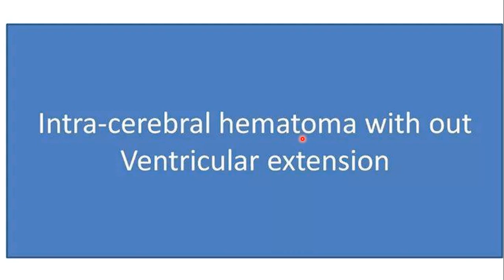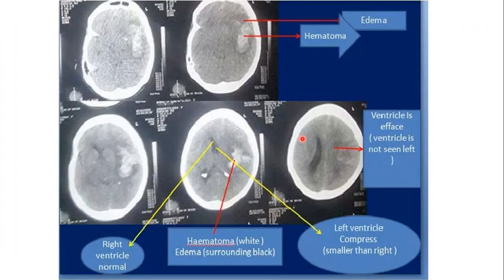Let's see examples of intracerebral hematoma without ventricular extension and with ventricular extension. Without ventricular extension, the hematoma is completely surrounded by brain parenchyma, does not reach the brain surface, and the overlying subarachnoid space is normal. The ventricles have no blood in them, indicating no intraventricular extension, and the cerebral sulci do not have increased density, indicating no subarachnoid hemorrhage.